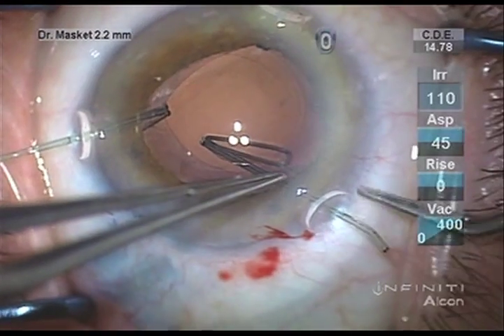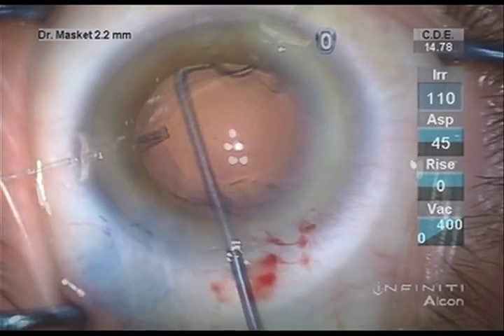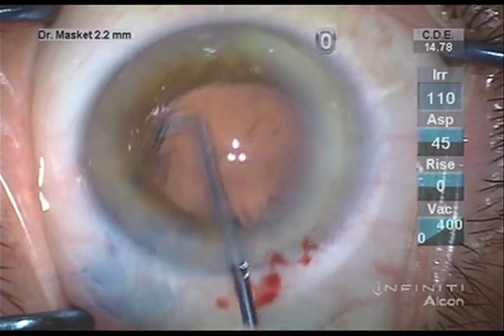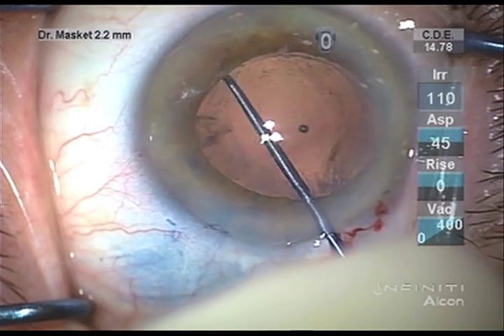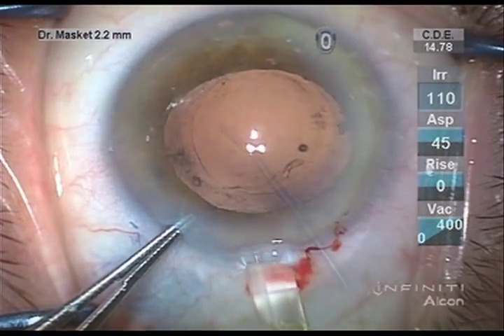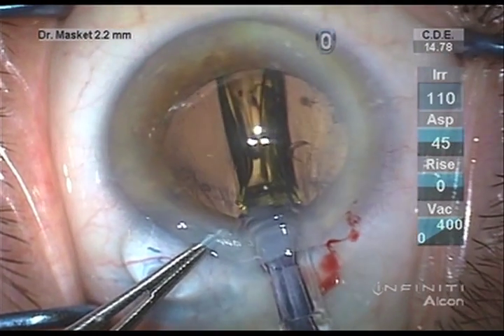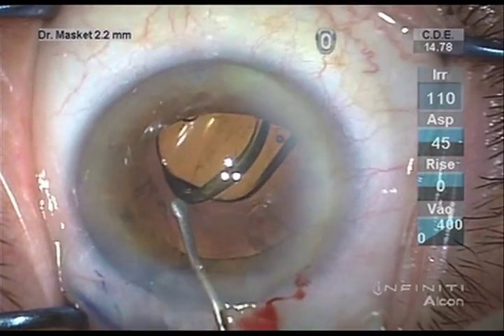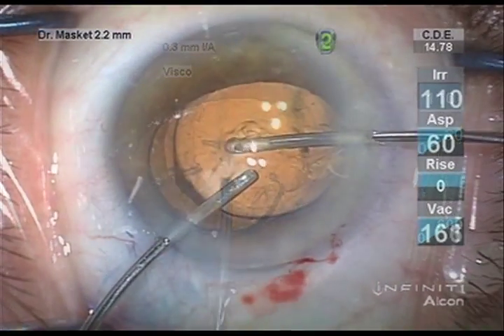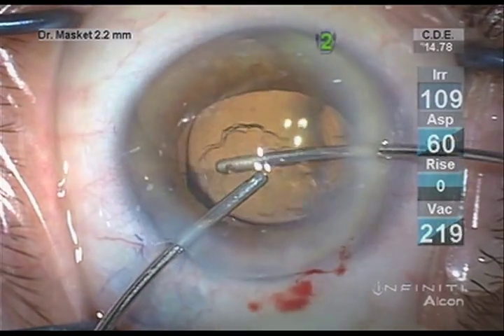At this point, the hooks are removed from the capsule bag and they can be removed either through the main incision or through the paracentesis. I am cleaning the subcapsular LECs with Shepard Carets and an instrument designed by the late Jack Singer. I think it is essential to remove LECs in order to prevent fibrosis in cases of weakened zonules. An Alcon single-piece acrylic lens is then positioned in the capsule bag using the epsilon inserter, and the viscoelastic agent is removed again in a bimanual fashion given the status of the zonules.